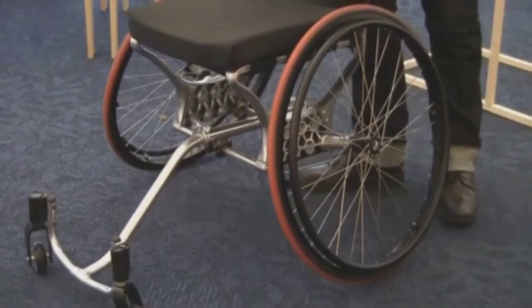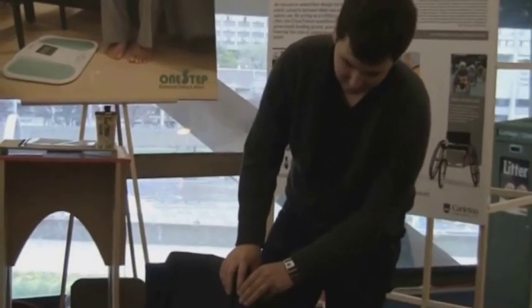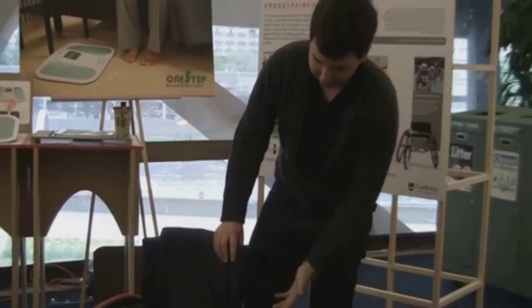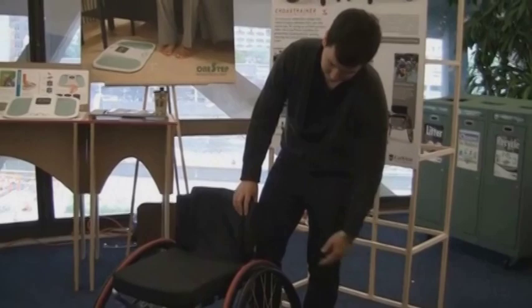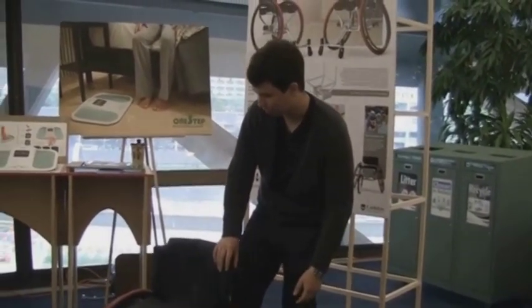For this prototype, I used the lost styrene foam casting method. I made all the frame members out of styrene, packed them in sand, and cast them into aluminum. A little bit of machine work to finish the parts off — some milling and some lathe work to make the ancillary components.